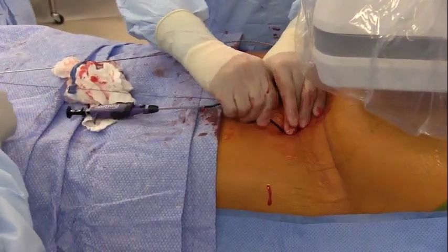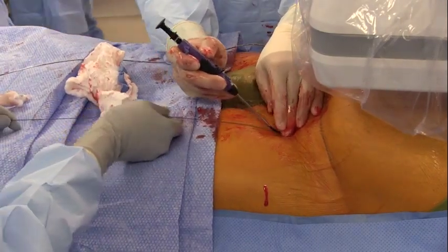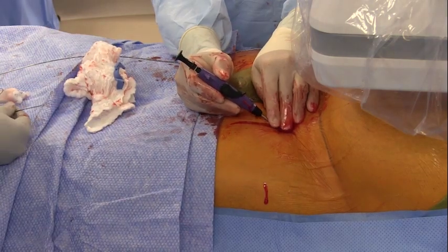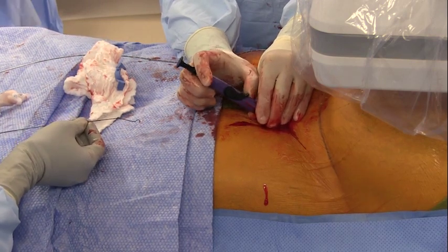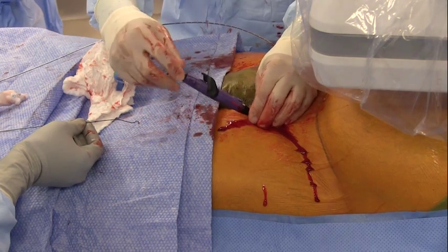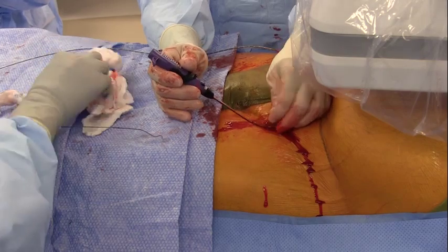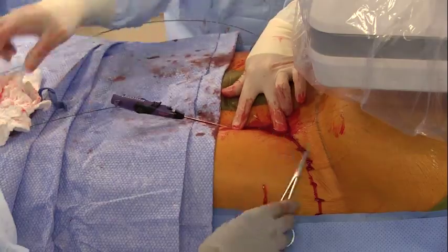At this point, someone unfamiliar with IVUS would normally advance an angled hydrophilic guide wire through the contralateral sheath beyond the renal arteries at L1 or higher. Then insert and advance the pigtail catheter until the tip is above L2. Remove the wire and connect the pigtail catheter with the power injector. Angiograms during the procedure will be performed using this catheter. In this case, we have elected to skip this step to minimize contrast, and we will rely on the IVUS to mark the relevant anatomy.